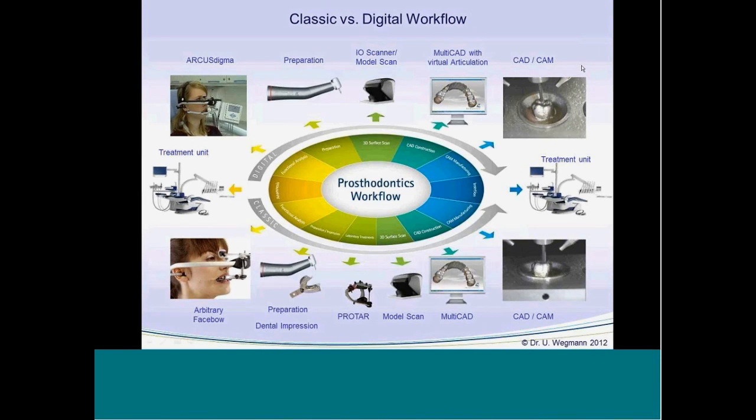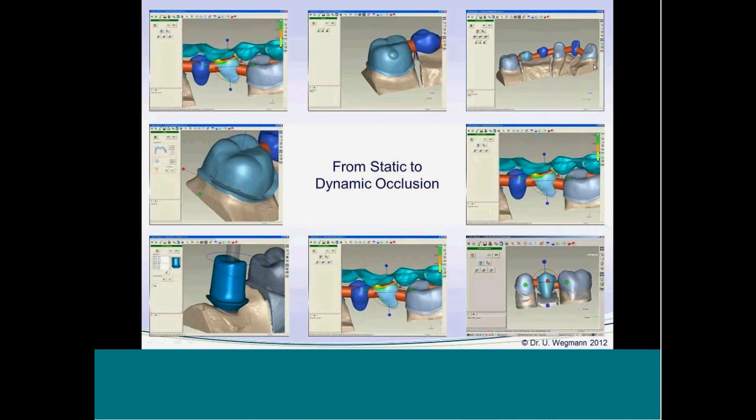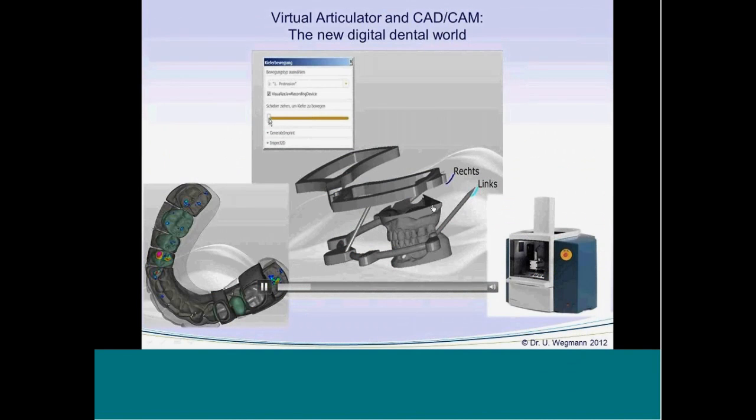Here our virtual articulator. It's a new digital dental world, as we can call it now. Here you can see the movement, the real movement of the patient is transferred to a virtual articulator, and you can follow all these movements, and you can use these movements or this information for the design, but not only for the design, but also first, of course, for diagnosis.